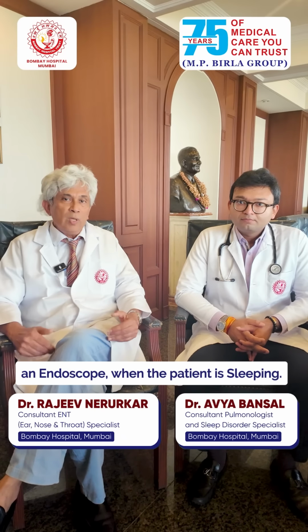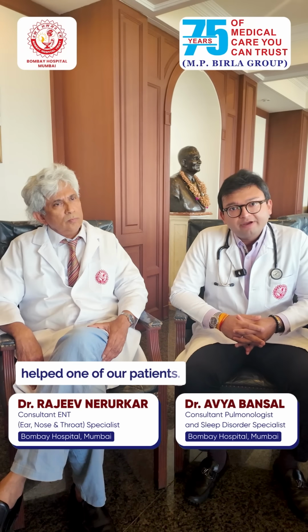This helps us to actually make our diagnosis more correct, gives us the areas where there is obstruction which needs to be addressed, and when we do plan for surgery, this tells us which are the surgeries which are going to help this particular patient. So let's talk how DISE actually helped one of our patients.